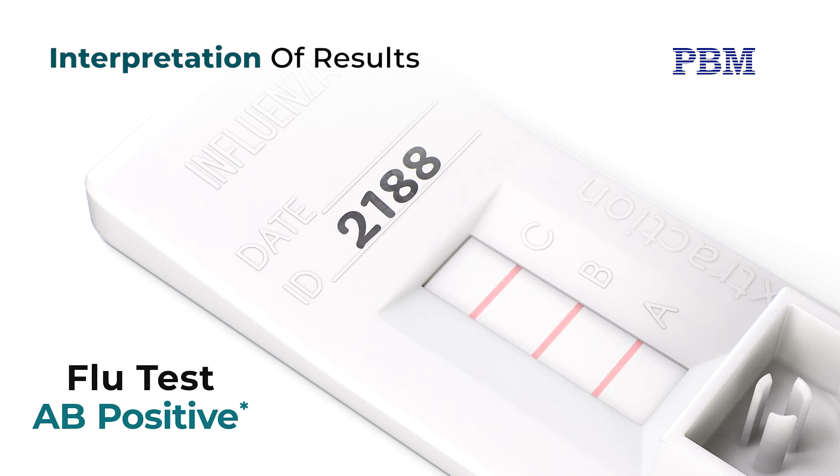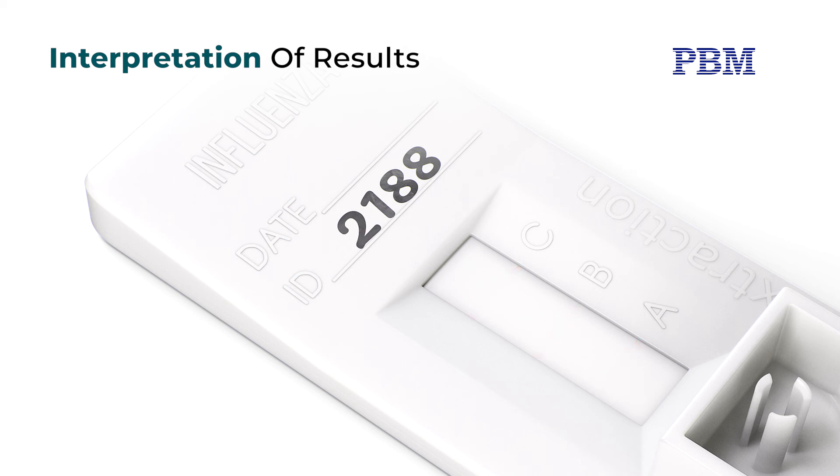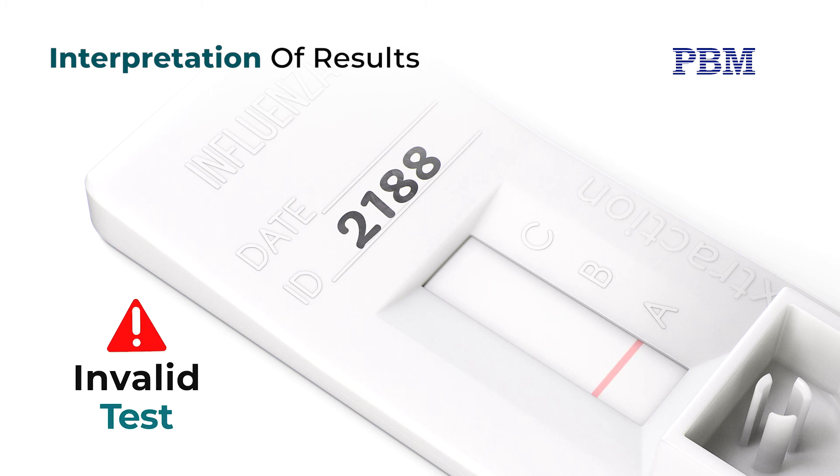Co-infection with influenza A and B is rare and should be retested. Repeatable dual positive results should be confirmed by PCR before reporting results. A reddish purple line should always appear at the control line. If the control line does not form after 15 minutes, the test is considered invalid and should be repeated using a new BioSign Influenza A and B test device and specimen.